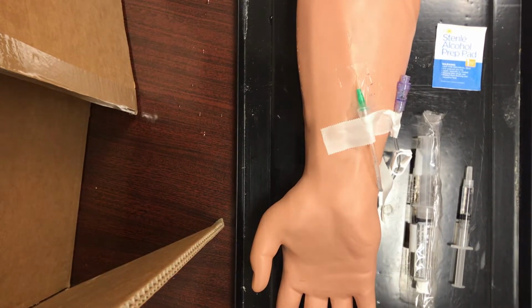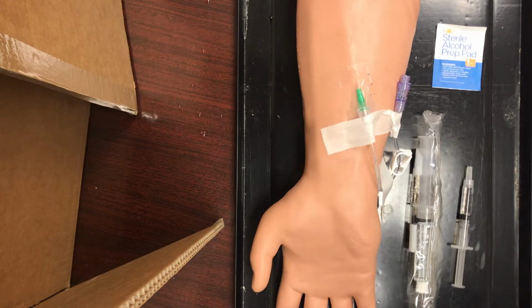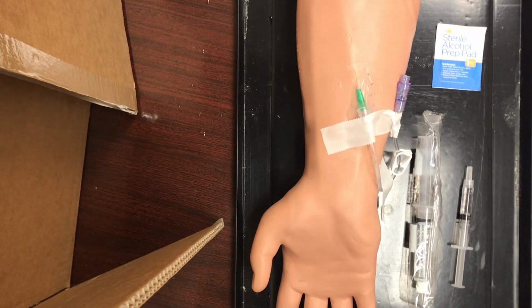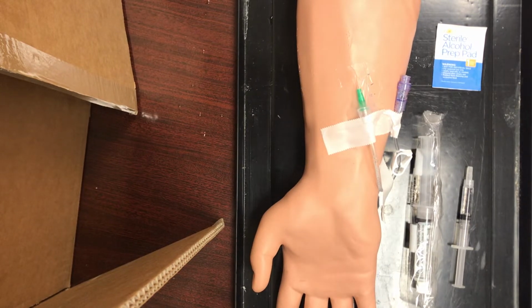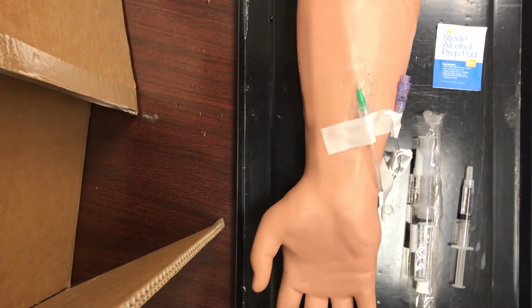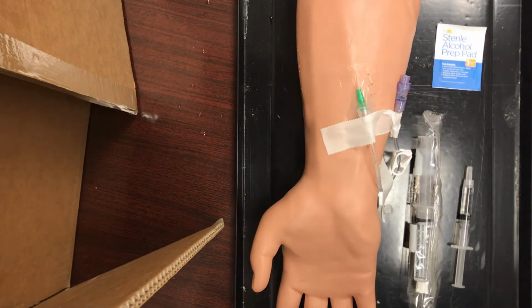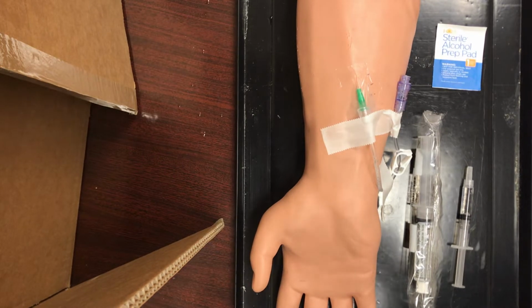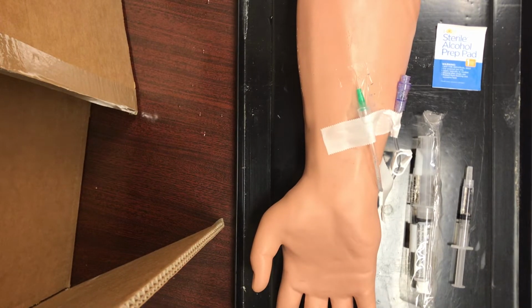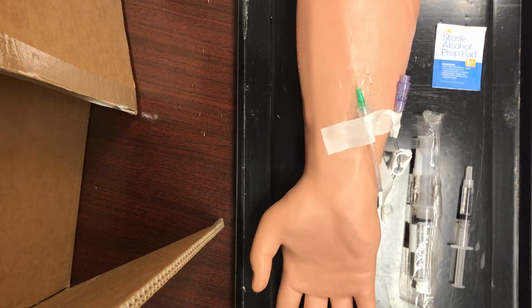And then we also want to ensure that the situation is safe for both the patient and myself as their nurse. Next, we want to check the doctor's order, and we'll check that on the MAR, which is found in the patient's chart. After we've checked the MAR, we're going to look at our patient. We're going to ask them if they are allergic to any medications, and then from there we can start looking at our medication itself.